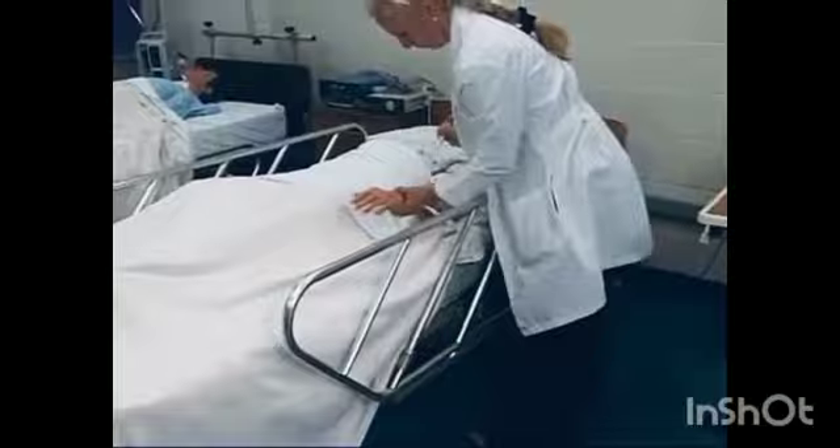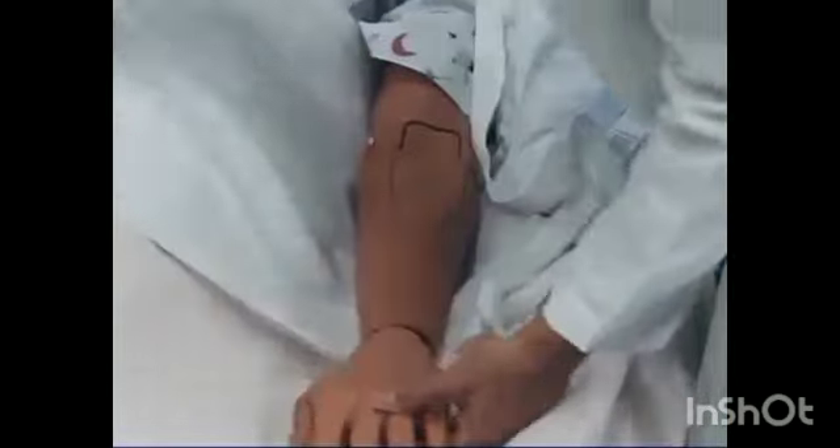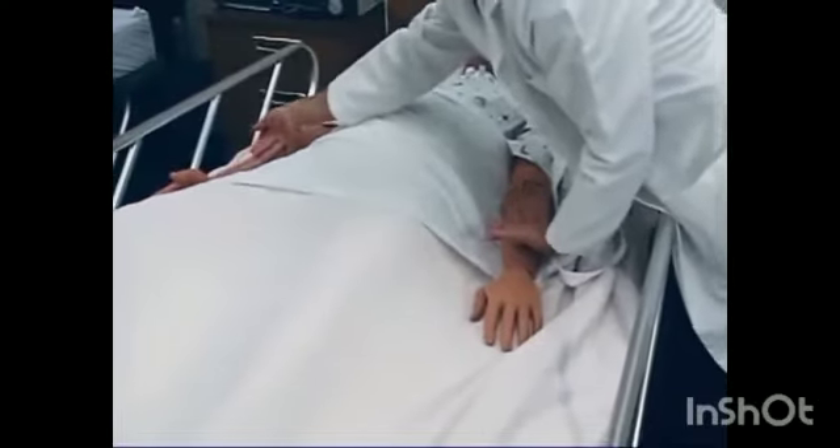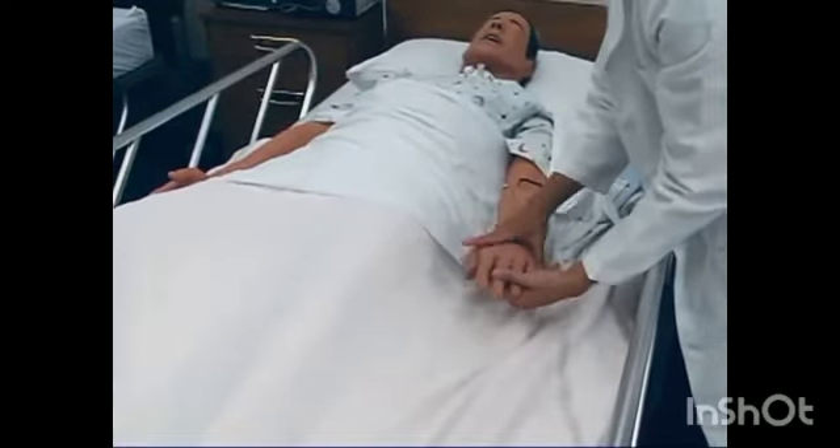Restraints must be assessed and documented every 15 minutes, and they are to be removed every 2 hours to provide range of motion exercises and to check circulation and skin condition.